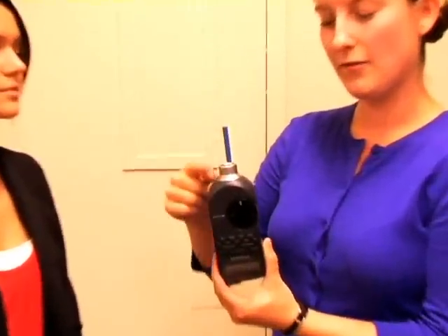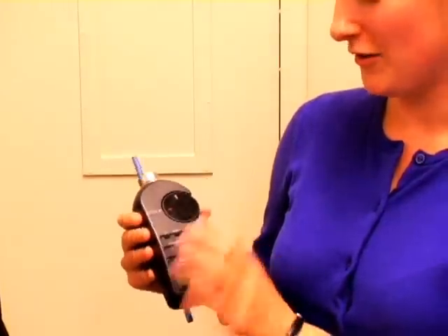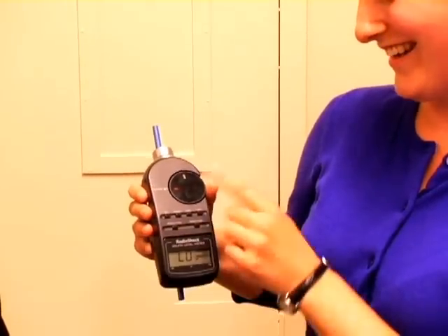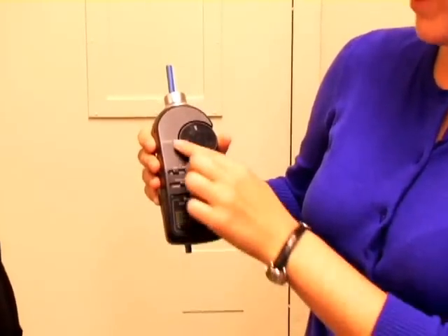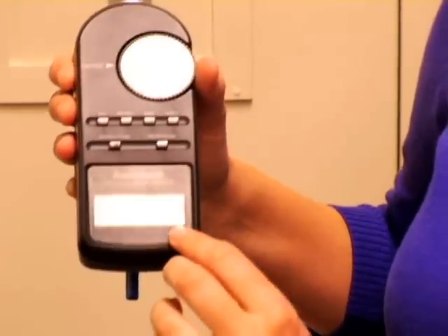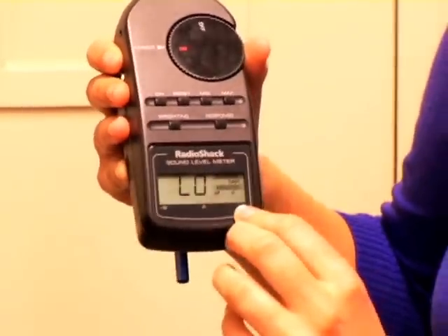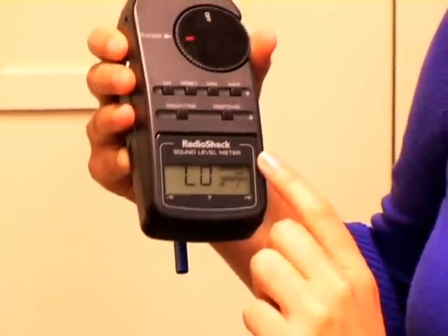Now we are going to demonstrate the use of the SPL meter during the sustained phonation of the vowel AH. Notice I have added a straw to keep the distance from the microphone to the mouth equal and consistent. You turn the dB SPL meter on, and I have put it at the range of 80 decibels. The weighting is on weighting C, which is the recommended weighting for the use of the RadioShack sound level meter, and the response is fast.